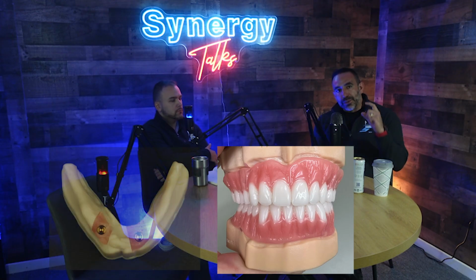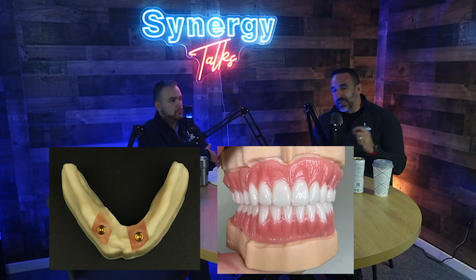In my opinion, again, this is my opinion, if the denture is properly supported by tissue and we do not put too high of a locator abutment in place, there's no reason for fracture. It's the same methodology as if I have a piece of glass flat on the floor and I step on it and it's 100% flat, the probability of that glass cracking is minimal to none. But if there are little pebbles on the floor, those are little fracture points where it's going to flex, and then that glass is going to break.